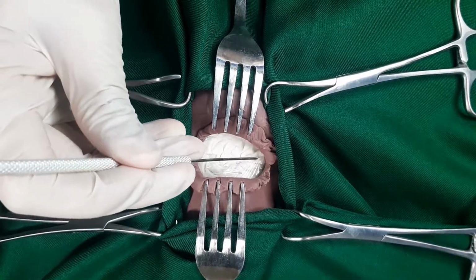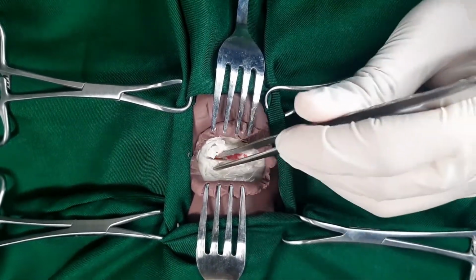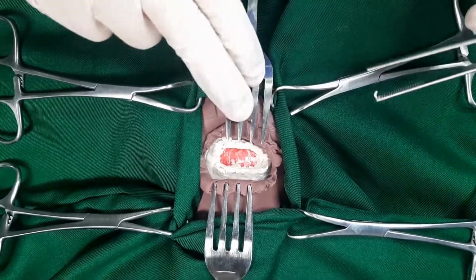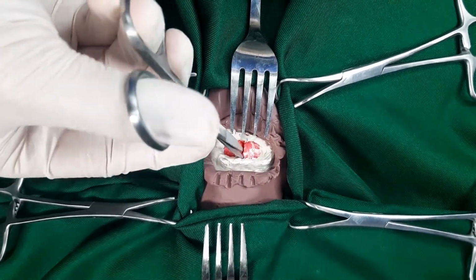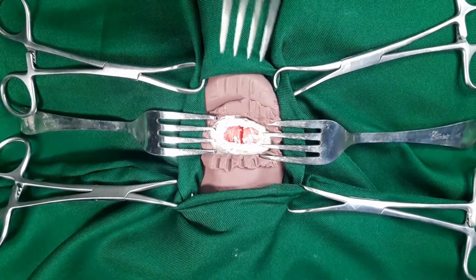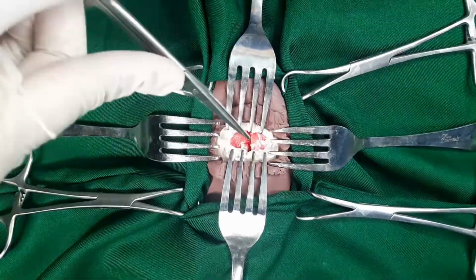and the subcutaneous tissue is then dissected using an electrocautery. Intermittently palpating for the airway at this point is important as it is easier to stray from the midline. Once the fascia has been cleared away, identify the strap muscles and retract them laterally. Then, expose the trachea by carefully parting the overlying soft tissues with a pair of scissors.